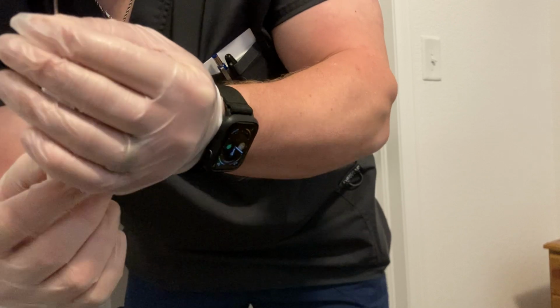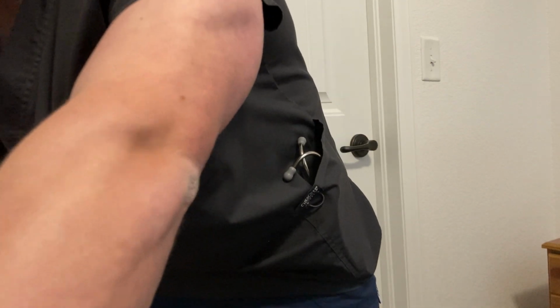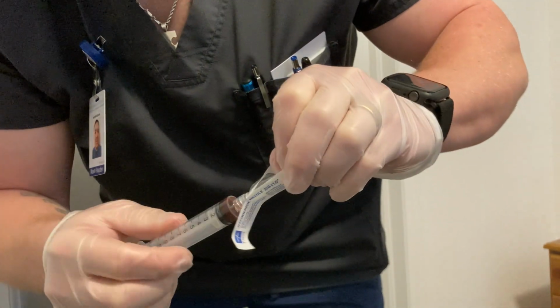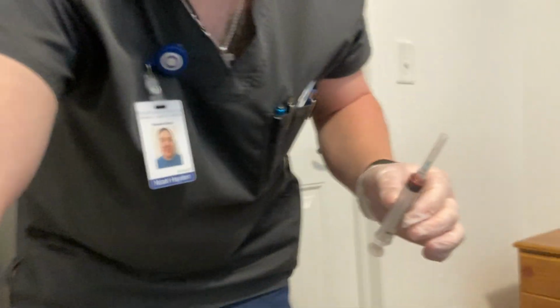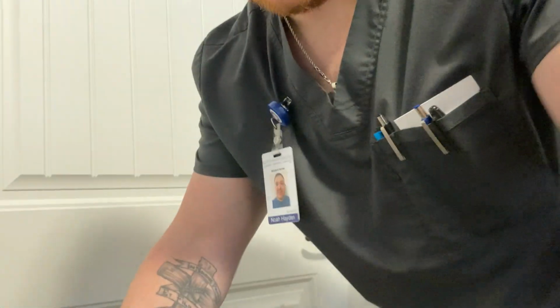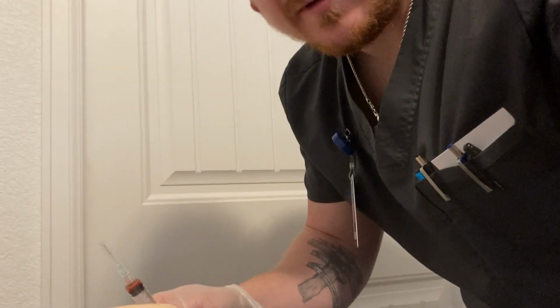I will remove my fill needle and I will dispose of it in a sharps container, and I will apply the appropriate injection needle, and I will go to my patient. Okay. Go to Mr. John Smith at the bedside. Here will be my bedside demonstration. All right. I now have my 1,000 units of heparinized solution.